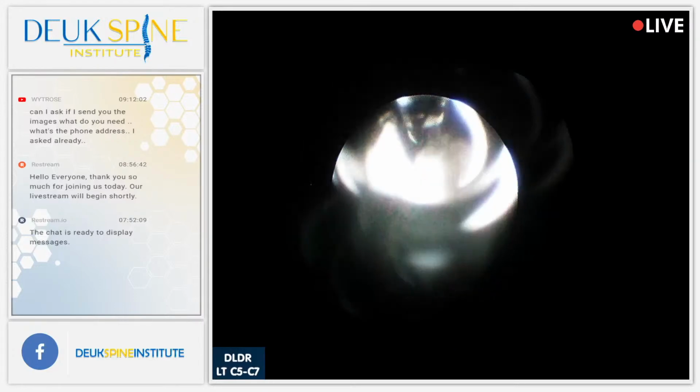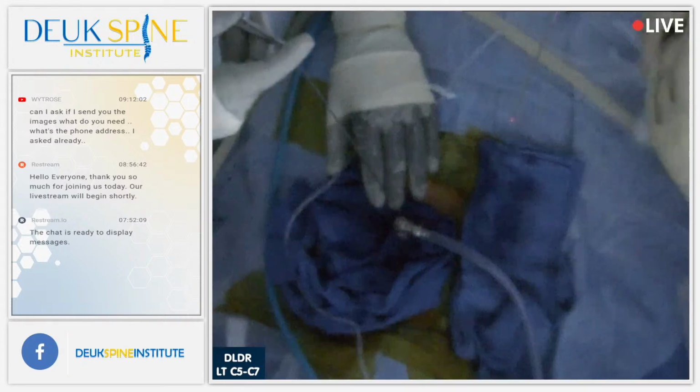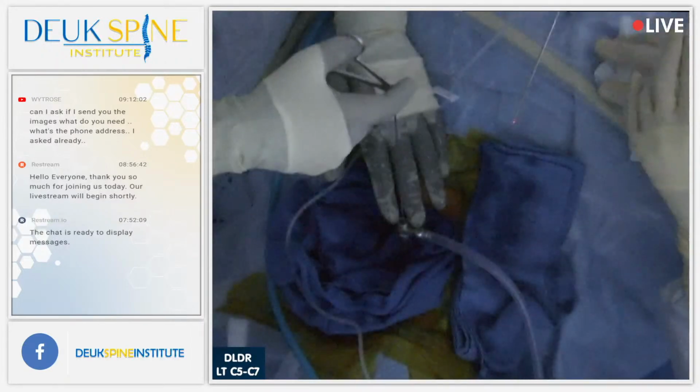That is a big herniation, and it's sitting right where the tear is. I'm going to try to grab it out because lasering it out will be too hard. I'm going to grab it and try to pull it out. The laser is used to free up the fragments. It's also used to debride the annular tear.